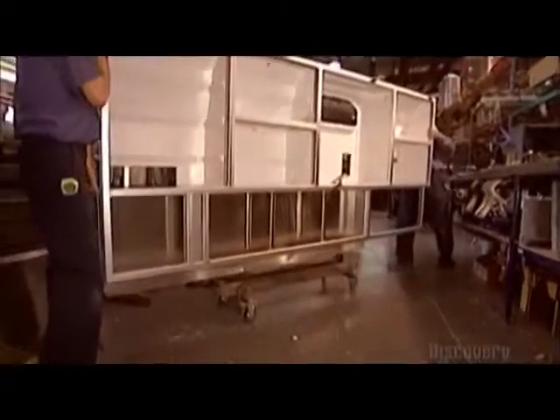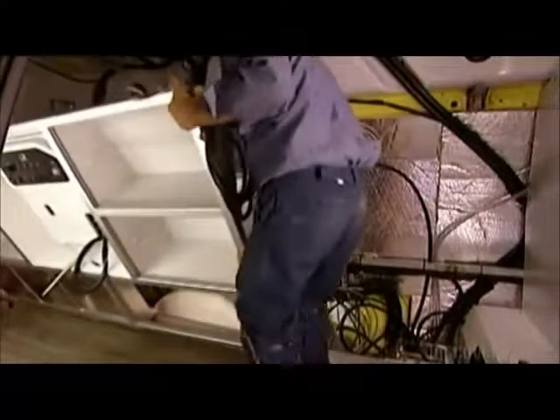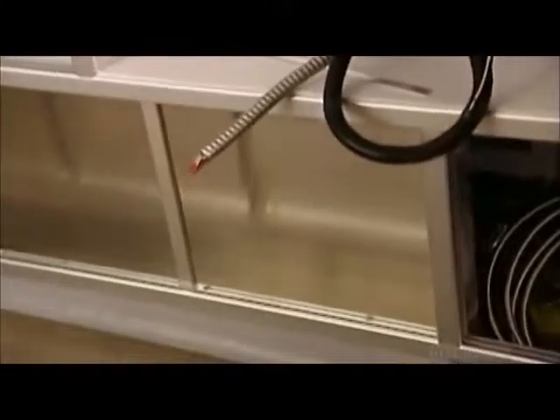After installing the suction and oxygen systems, electricians run the wires for the cabinet lighting. Once the main electrical panel is in place, they can mount the cabinet and hook up the oxygen equipment, the suction machine, and the lighting.